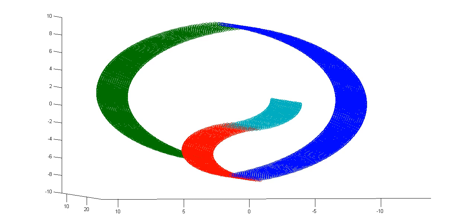There's basically some subset of fMRI experiments where the simplest version would be that you do your per-voxel analysis on each subject, and then you average the brains across subjects. You might see that some things you've looked at hold true at an individual subject level, and even after averaging across subjects, you see something. And there are more complicated ways of doing it; it doesn't just have to be averaging. But you can see that a phenomenon is robust across individuals, and then you could imagine that a classifier would hold across individuals to some extent.